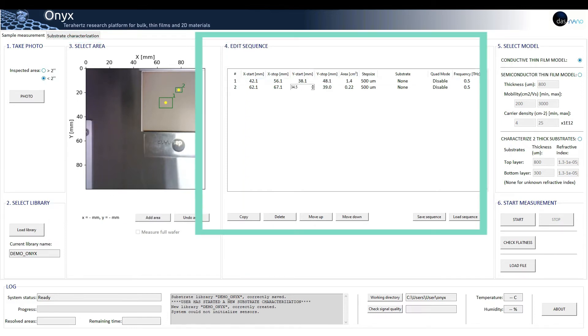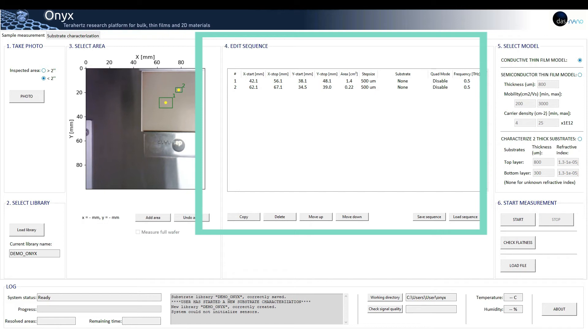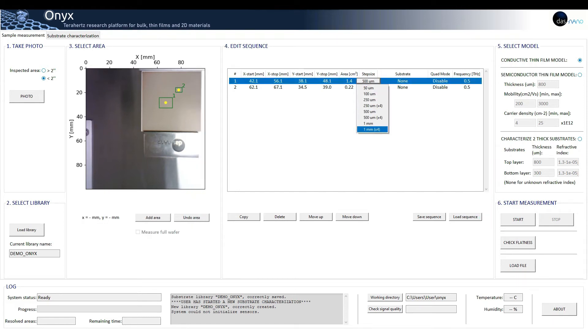Four: edit sequence. This section allows the user to choose the characterization parameters for each area added, such as size, step size from 1 mm resolution to 50 microns.